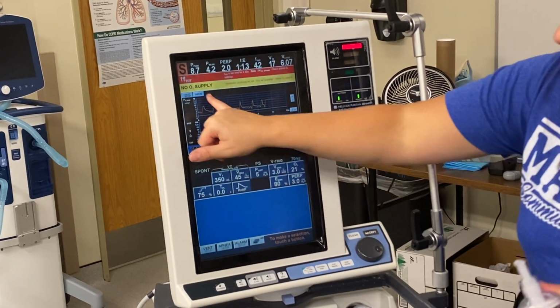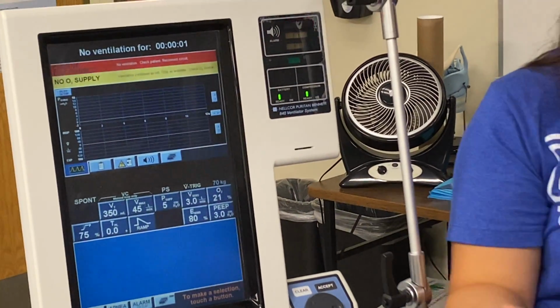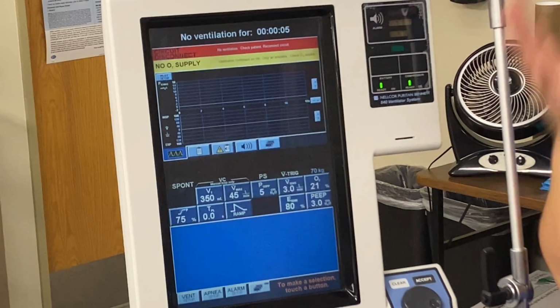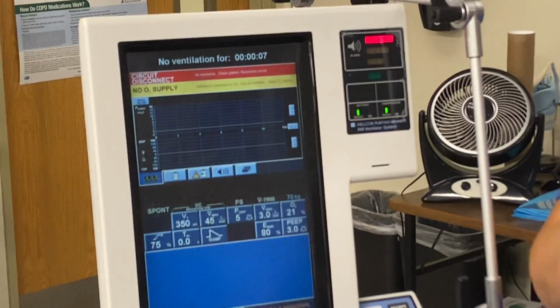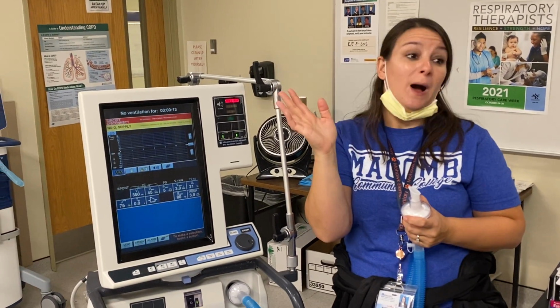So a couple of things about what you're seeing: one, I'm not getting any volume. Two, my breath is not even happening. It's just ending, ending, ending. So that tells you that your rise time is too aggressive. It's set too high, okay?